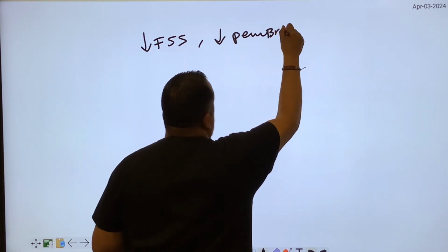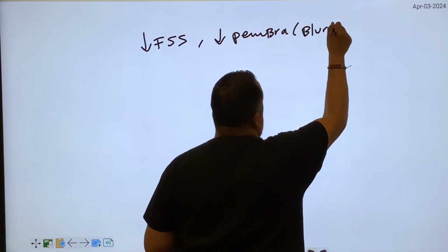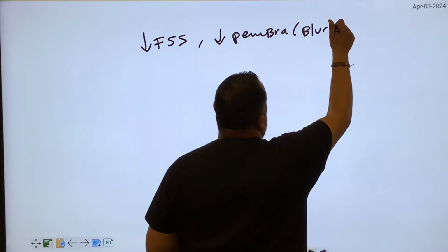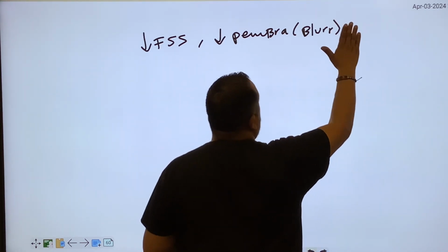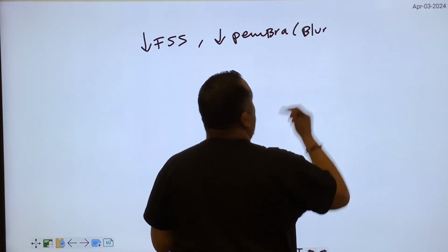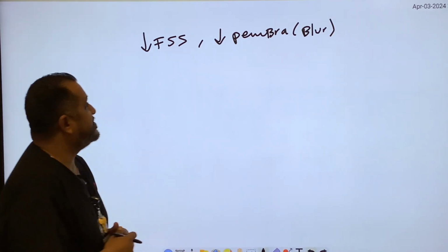If you remember, another word for penumbra was blur, correct? Is it 2 R's or 1 R? Is it 1 R? 1, right? Okay, thank you. So blur is going to be 1 R.